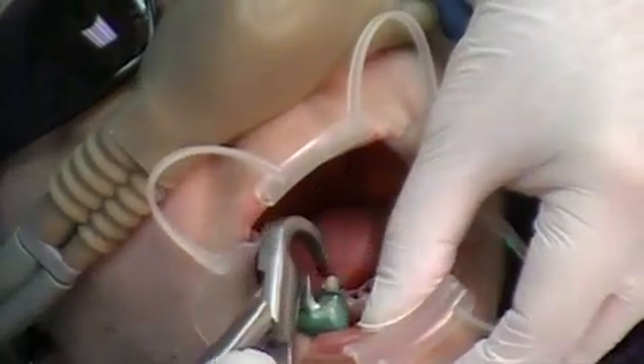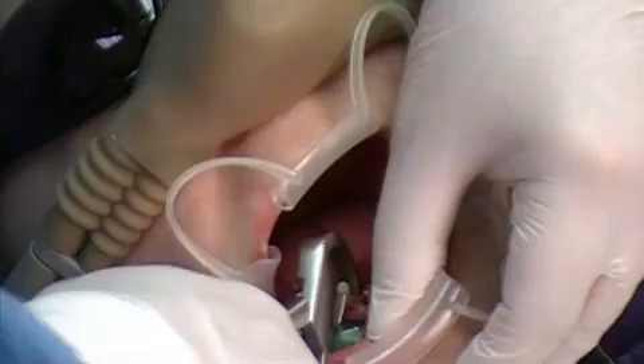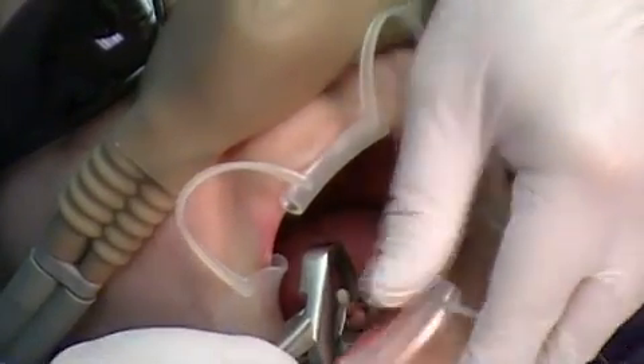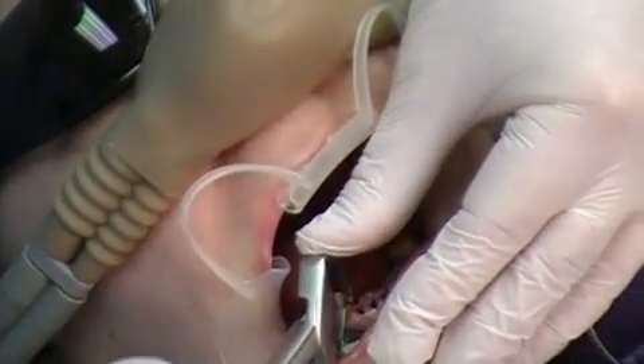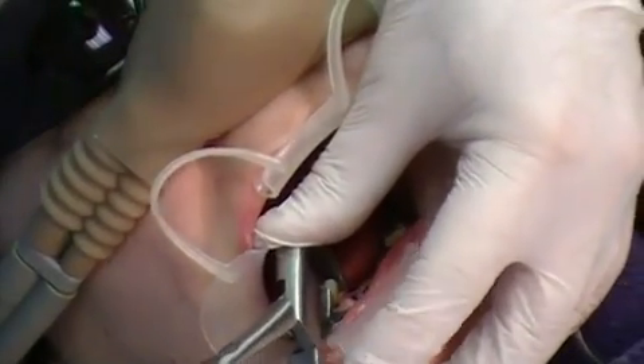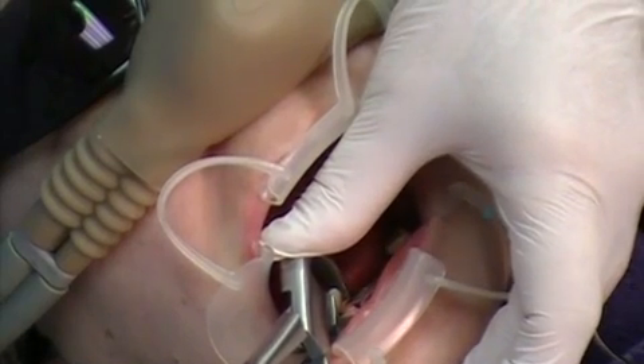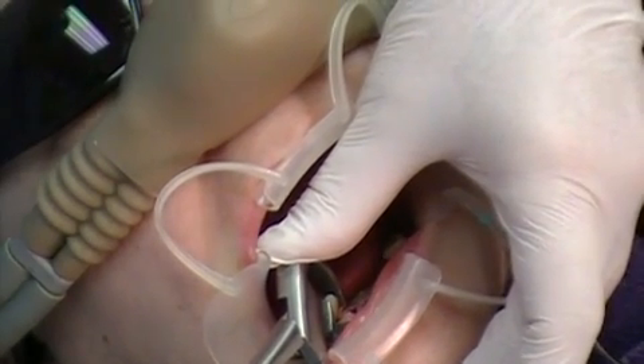So we're coming back to the cuspid tooth, engaging the lingual surface of the tooth with the beak, and putting the bumper on the facial vestibule area, down by the mucogingival junction.